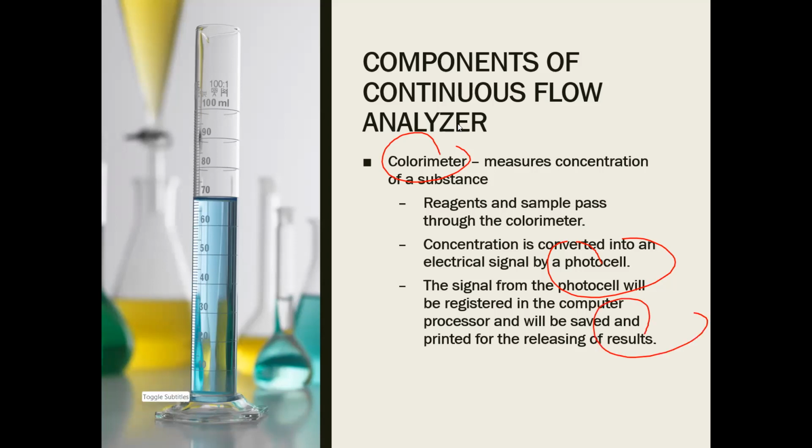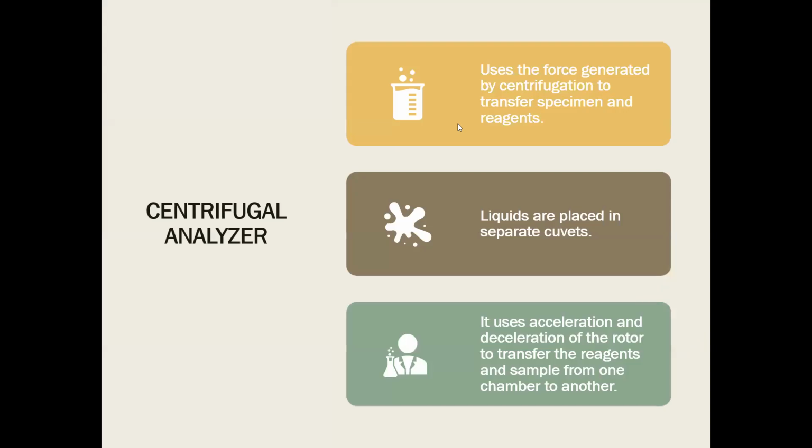Okay, so that is our continuous flow analyzer. Moving forward to our centrifugal analyzer: when we say centrifugal analyzer, it uses force generated by centrifugation to transfer specimen and reagent. Usually, our liquid samples are placed in separate cuvettes.